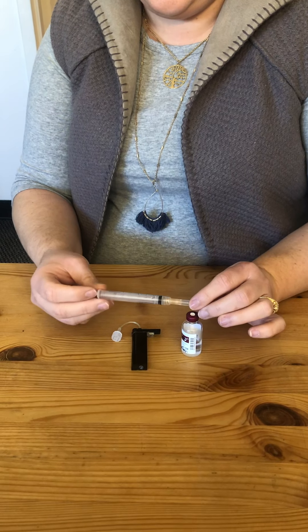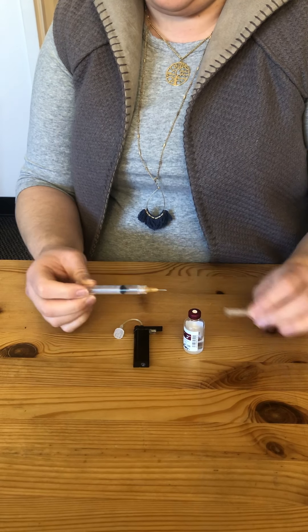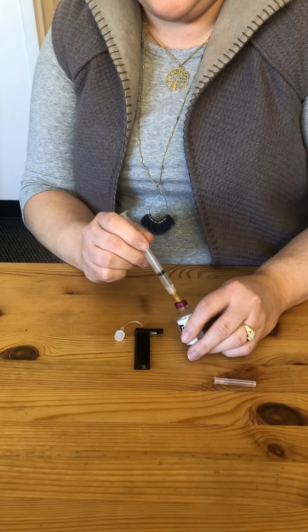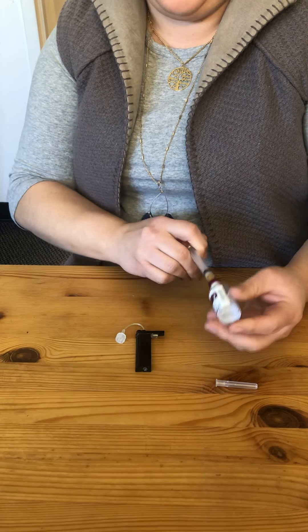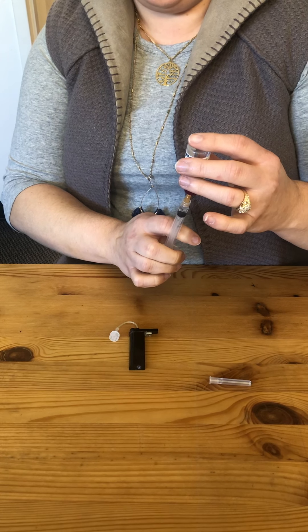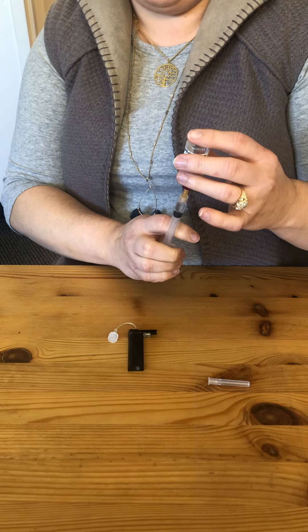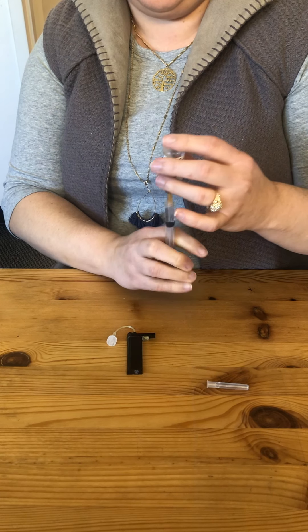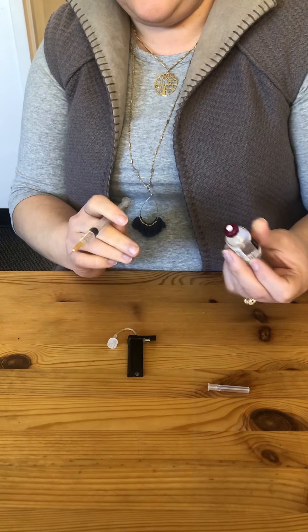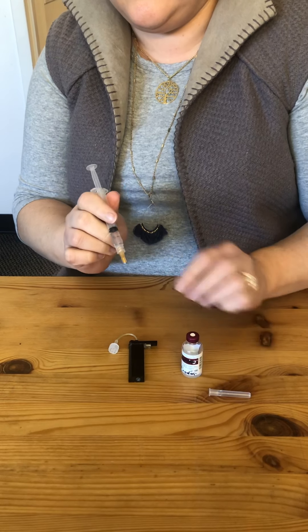What I'm going to do is first draw up about 1 ml of air — that's about 100 units. I'm just going to put the air into the vial and pull up this much insulin. I don't use 1 ml, I'm just pulling up an arbitrary amount and I'm not going to be super careful about getting bubbles out at this point, because this isn't the insulin going in my body.